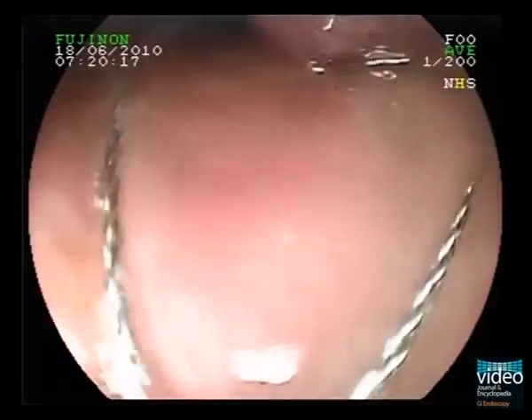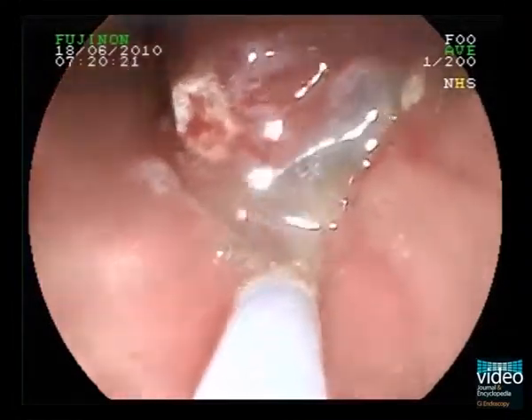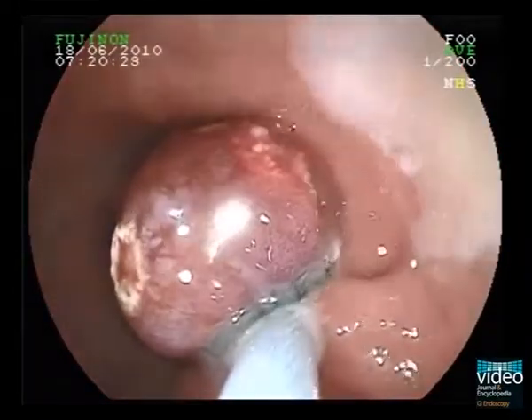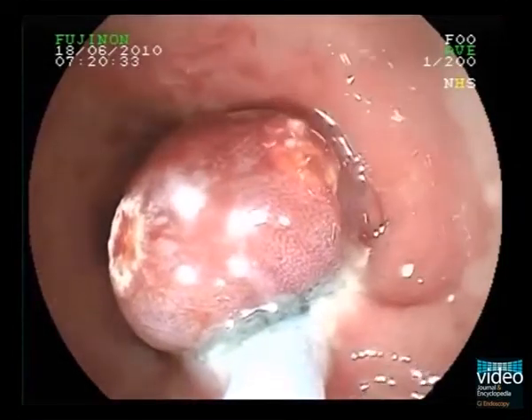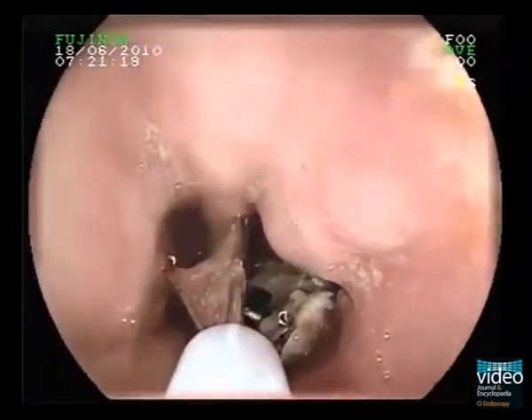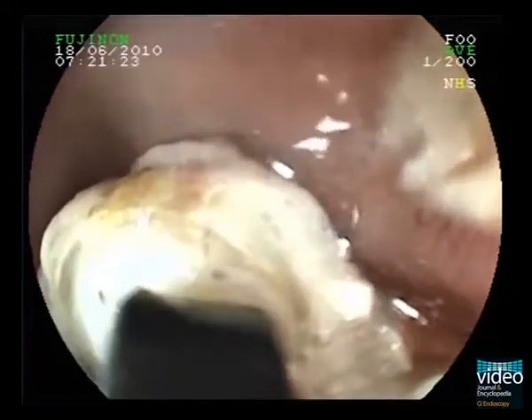The snare is advanced and placed over the pseudo-polyp. When closing the snare, make sure that the polyp is cut underneath the rubber band. Afterwards, the resected specimen is caught with the polyp grasper and retrieved.